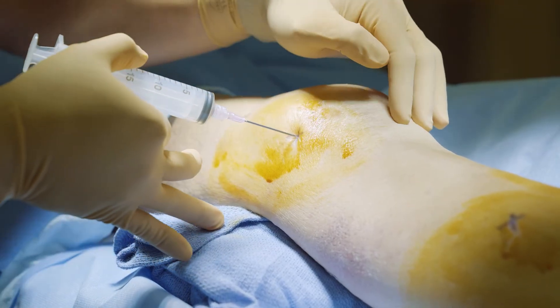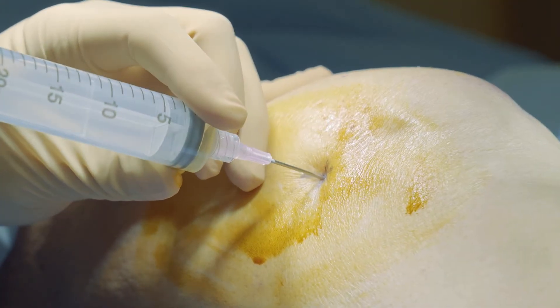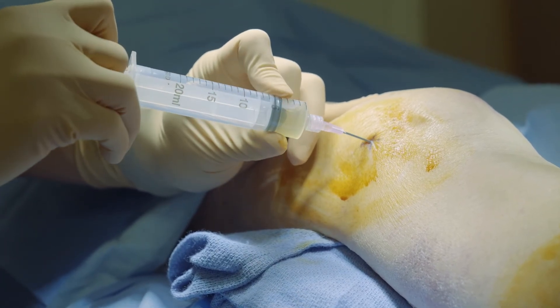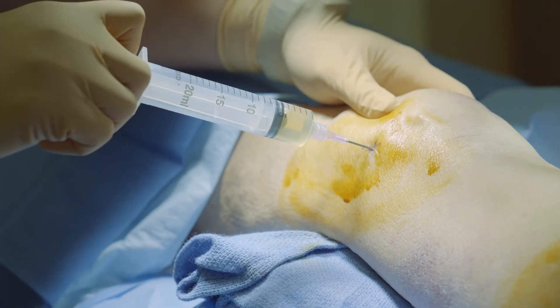Attach your 18-gauge by 1.5-inch needle to a 20 cc syringe and go along your track, aspirating as you enter the skin. If you hit bone, withdraw to the skin and redirect. Once you have entered the suprapatellar pouch, continue aspirating while milking the contralateral portion of the knee.